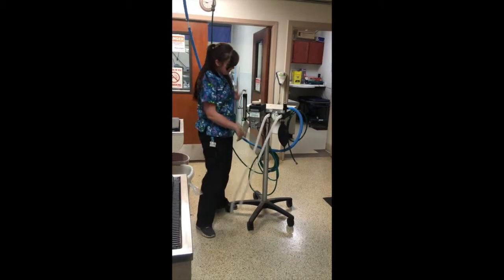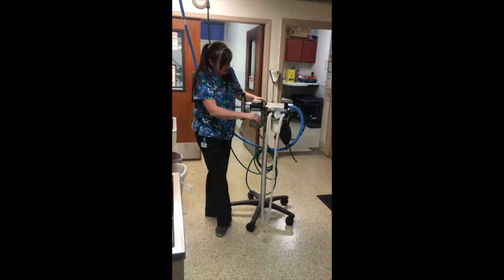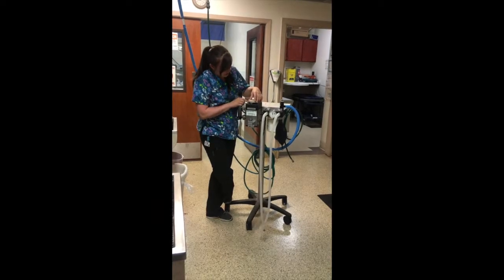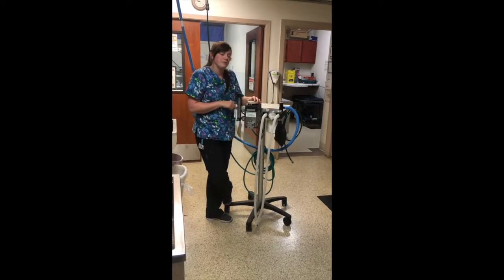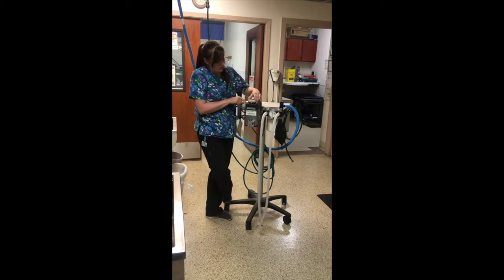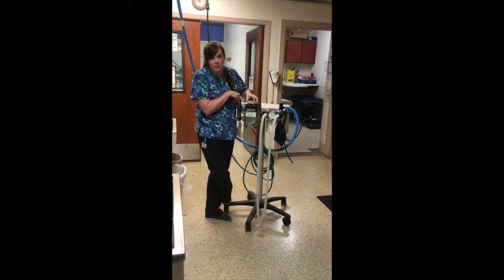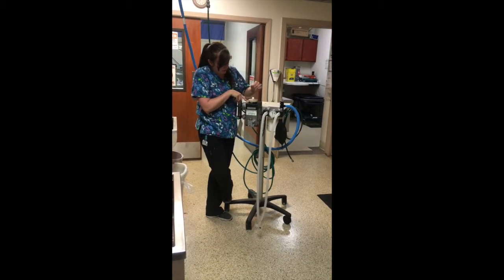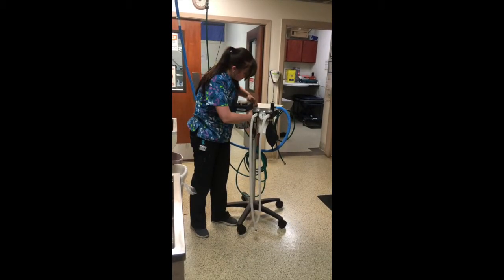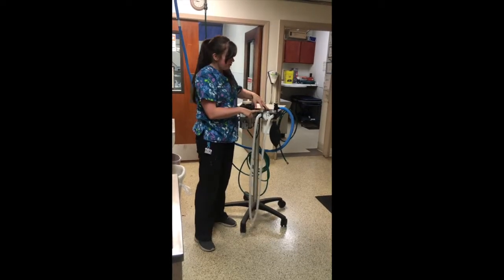So then the oxygen comes up to our vaporizer, which is filled with liquid anesthetic gases that are vaporized inside this machine, and we can turn on the flow rate or percentage that we want of that gas using this knob here. We want to make sure when we do turn it, we push down on the lock and twist the knob and let go, and that locks it in place. And then you can push it back and now it's locked. You can't turn it on by accident.